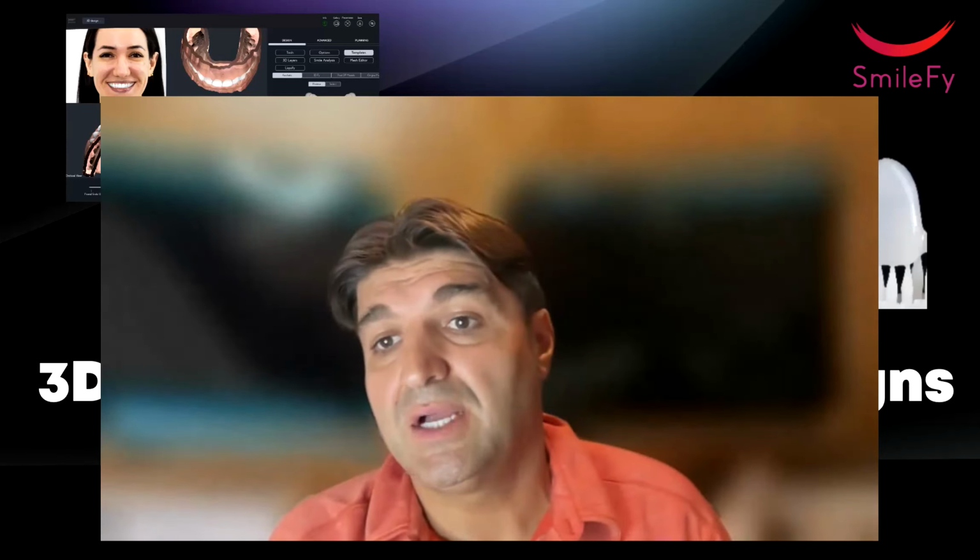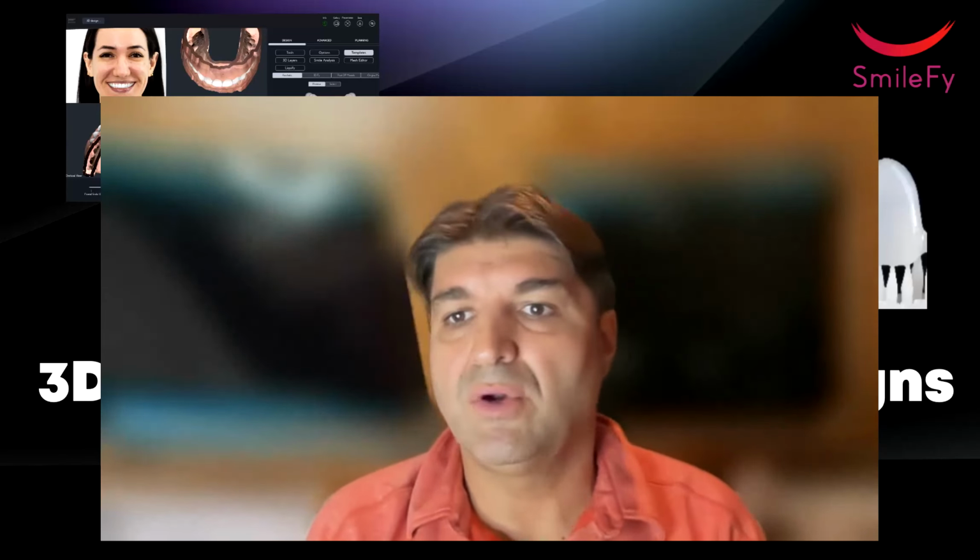Okay. Sure. So, what do you suggest for resin 3D printed veneers? There is Onyx resin from Print-Ready, and you can print full arch implant bridges. You can print veneers. More and more ceramic resin materials are now entering the market. Interesting. It's going to be more and more, and it's going to be very, very interesting.